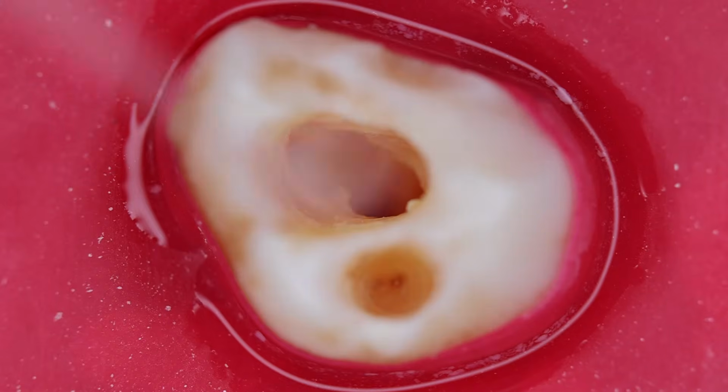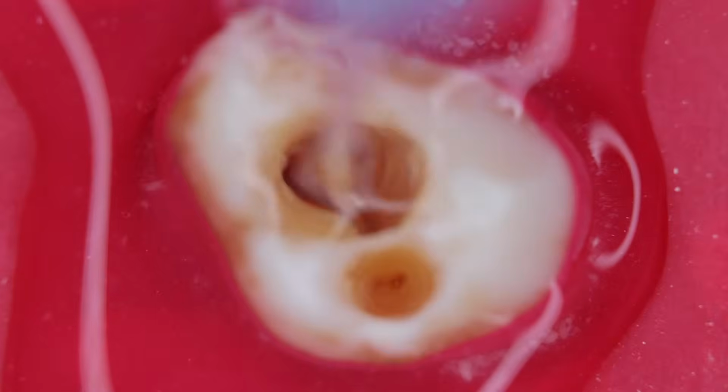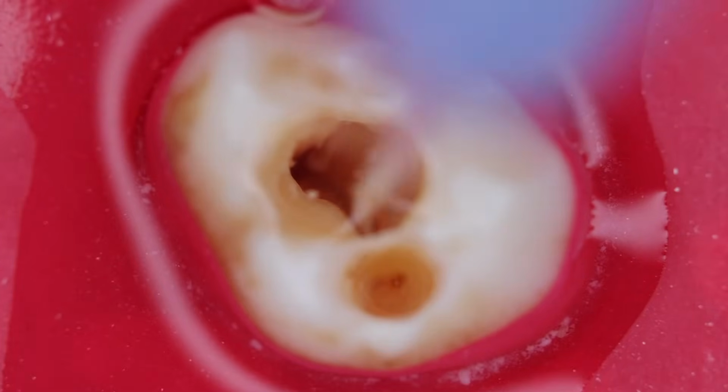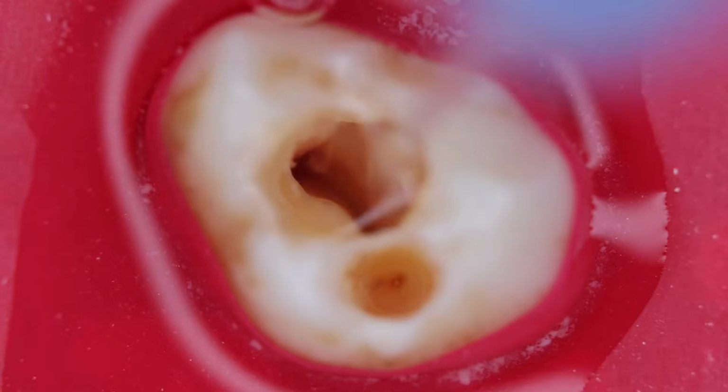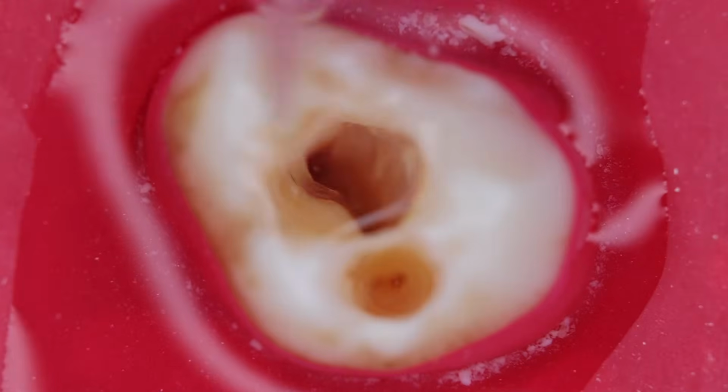So this is the normal saline irrigant. Now see how much debris would come out, as you can visually see. This is necessary when we don't have the microscope, and we need to visualize the canals so that we can clean and shape those canals.